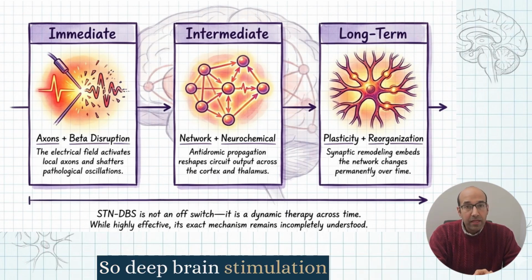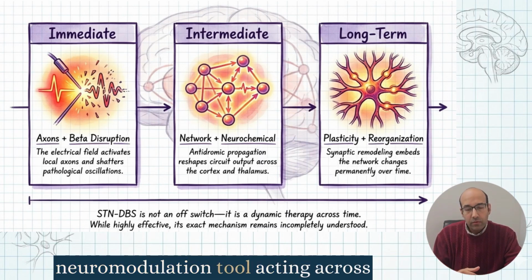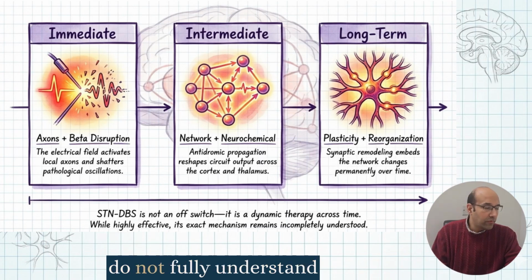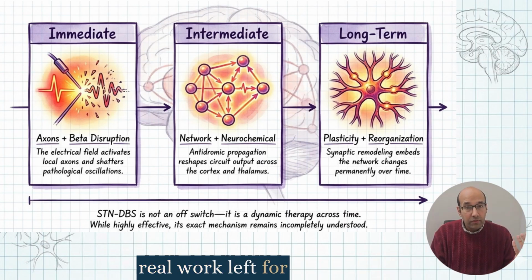So deep brain stimulation is not just a reversible lesion. It is a multi-layer neuromodulation tool acting across time scales. And even with all this data, we still do not fully understand every mechanism. That means there is real work left for the new generation of neurosurgeons and neuroscientists.